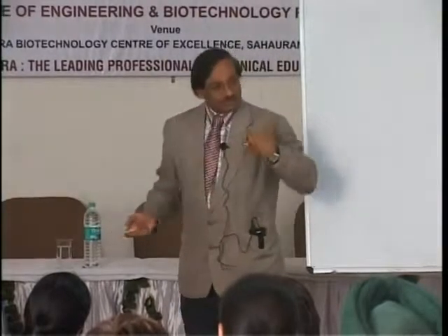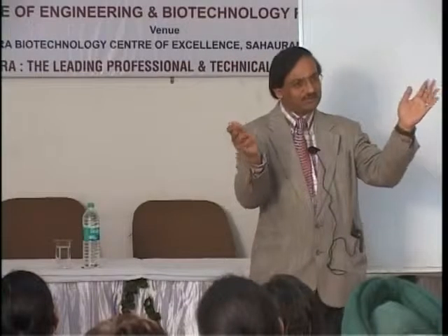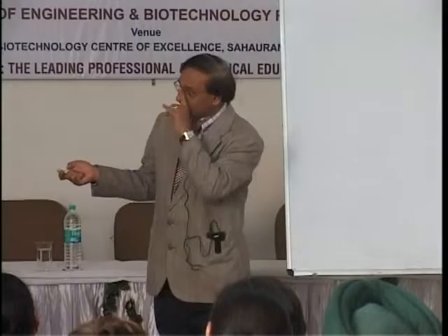When you are talking of the thorax or the abdomen, where there is respiratory movement, you cannot do it. So two sets of data can be fused when there is no movement, but two sets of data cannot be fused when there is movement. This you have to understand. Next.